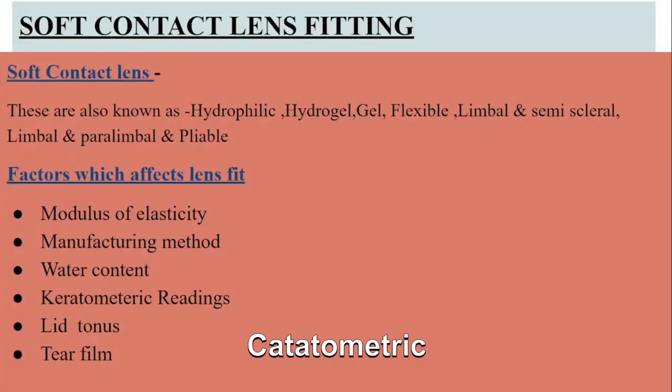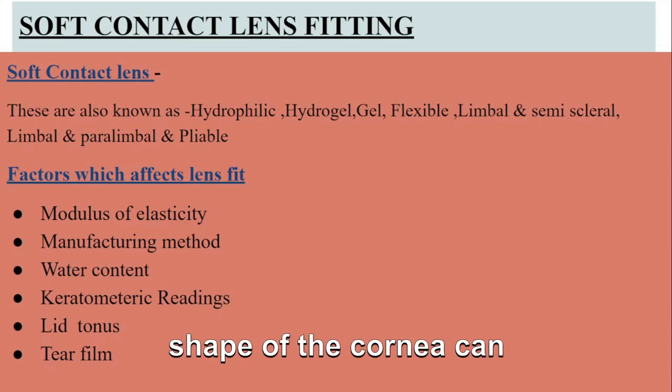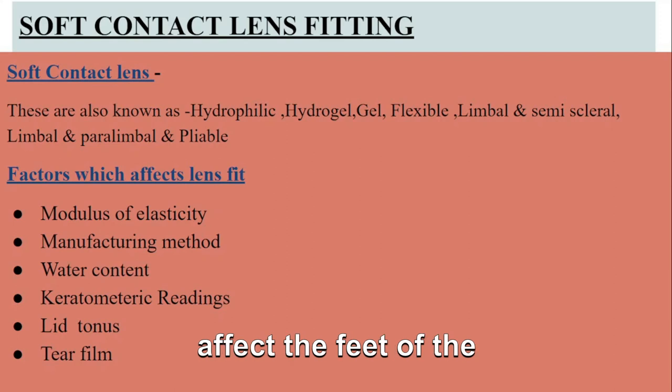Number four, keratometric reading. These readings measure the curvature of the front surface of the eye, known as the cornea. The shape of the cornea can affect the fit of the contact lens. Your eye care professional will take this measurement to help determine the appropriate lens size and curvature for your eye.